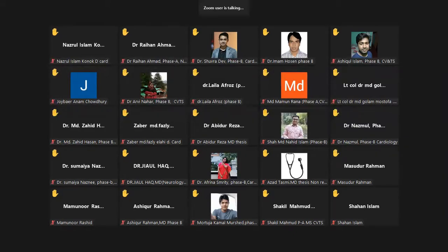These STT changes may be due to memory effect. This is number one. It might also be due to other causes of STT depression like ischemia, MI, non-ST-MI. So as Mohsin sir pointed out, this is less likely to be a memory effect. So the next question should be how we will differentiate between the memory effect and ischemia. So the answer is very simple.